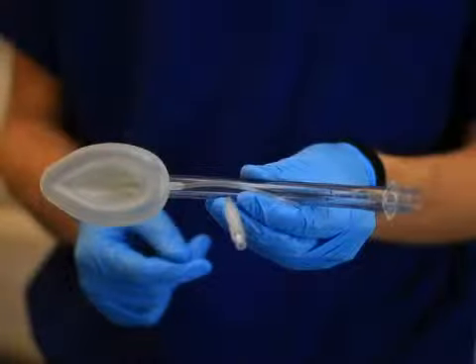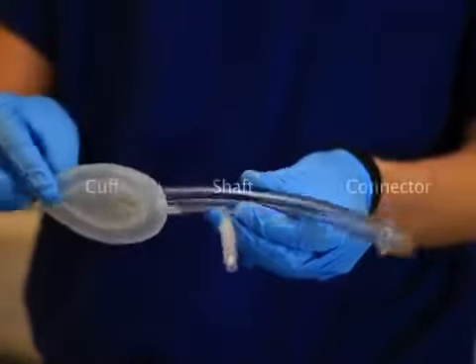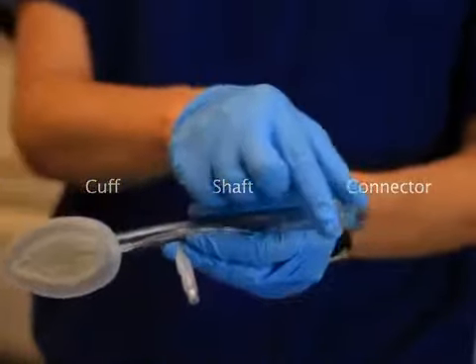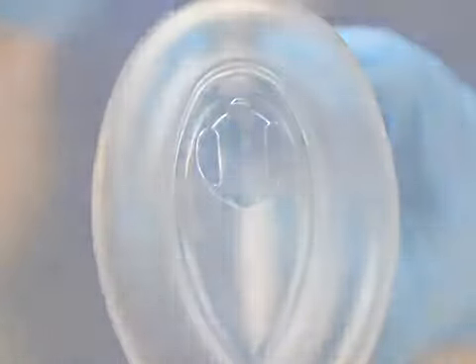An adult-sized laryngeal mask airway is a flexible breathing tube of approximately 25 centimeters in length with an inflatable bladder or cuff on its distal end. The proximal end has a standard 15 millimeter connector that allows attachment to any ventilation system. Air exchange occurs through the aperture on the distal end of the tube.